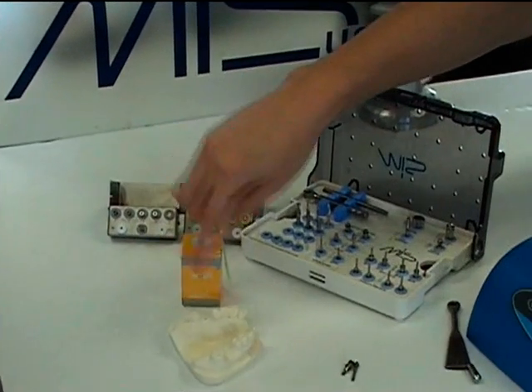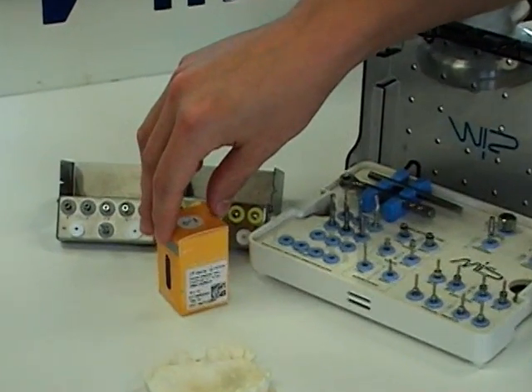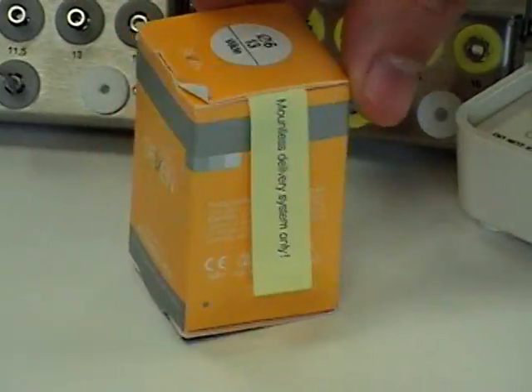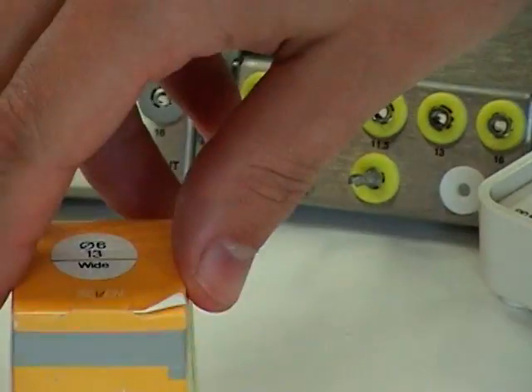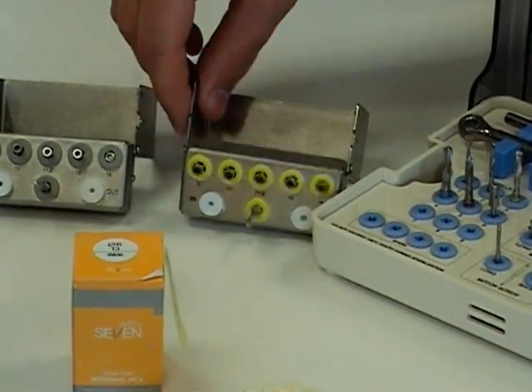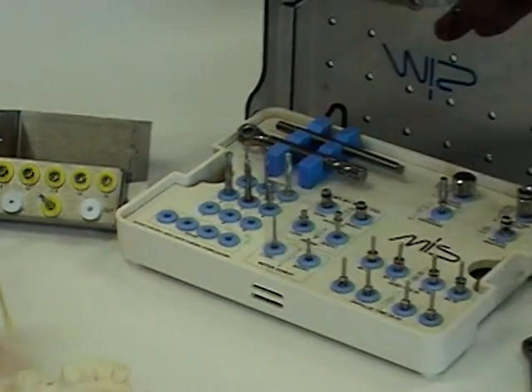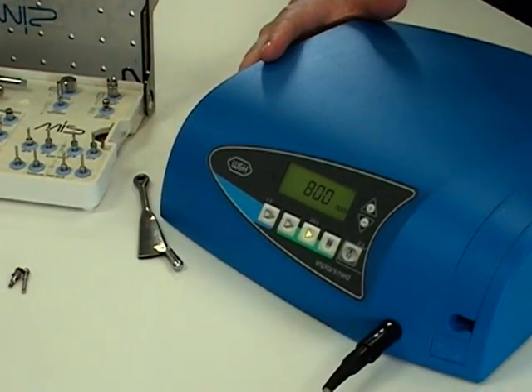We're going to be drilling the osteotomy to place a 6mm MIS-7 style implant, 13mm length. This is the new mountless delivery system style of implant. We'll also be using the 2mm drill stopper kit, the 2.8mm drill stop kit, and the MIS surgical kit in addition to the WNH implant med motor.